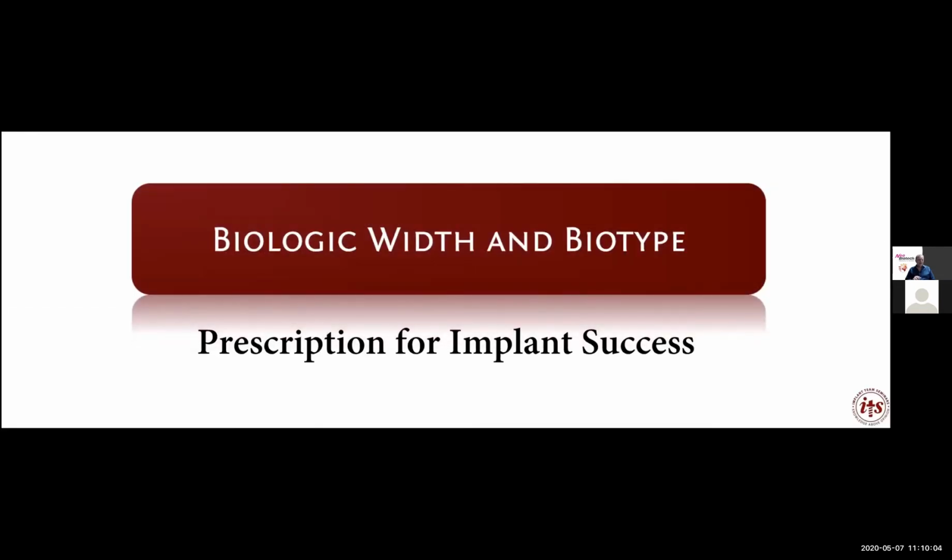The concept of biologic width describes the barrier between connective tissue and the implant surface. The understanding that there are specific biotypes is also necessary for success of implant-supported restorations, and we'll talk about this as the slides go on.